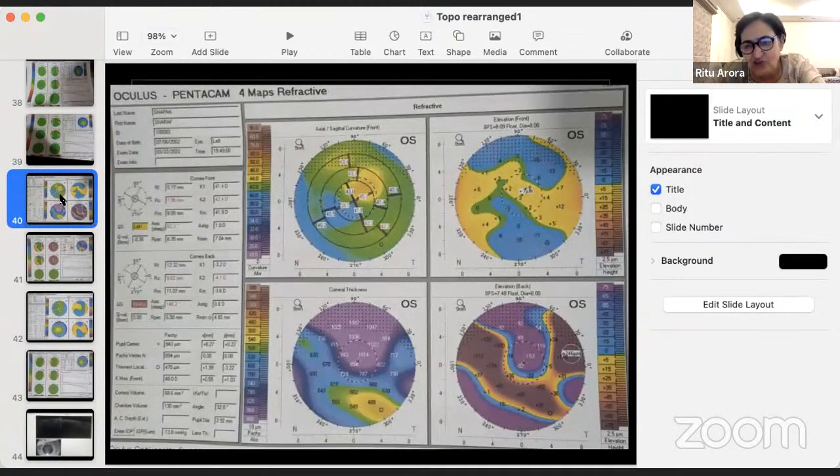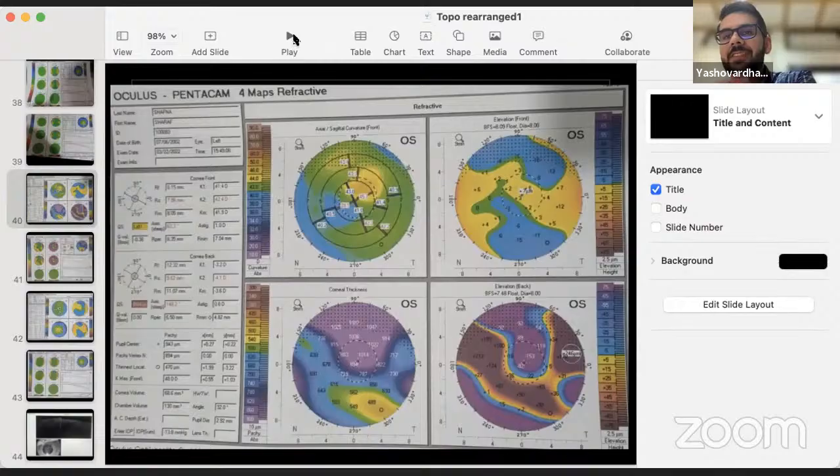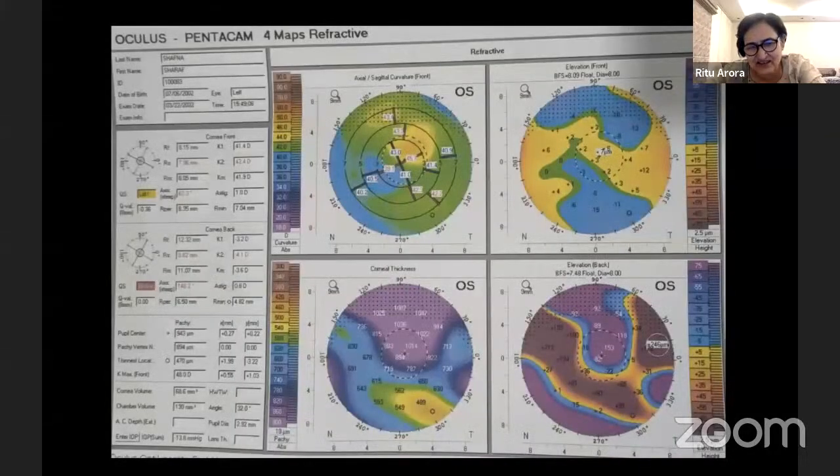Corneal thickness is markedly increased over here. Look at this area. Don't go by this thinnest locale here. It's absolutely fallacious. At least if you go by this, it's a very, very thick cornea here. And out here, maybe it's a normal cornea, and maybe a small point which is showing you 489. So it tells you at least one thing, that from a pachymetry point of view, it's a widely variable thickness of the cornea. And even if you see the curvature, highly variable, flat to something normal.